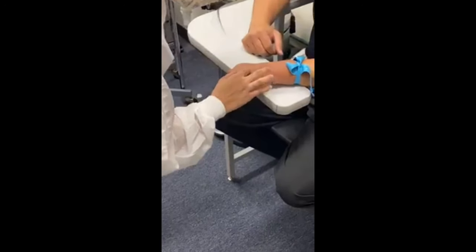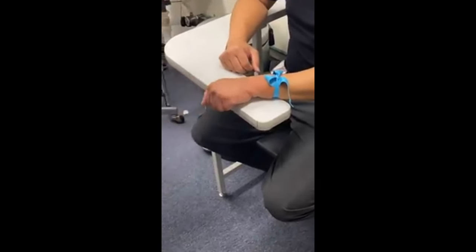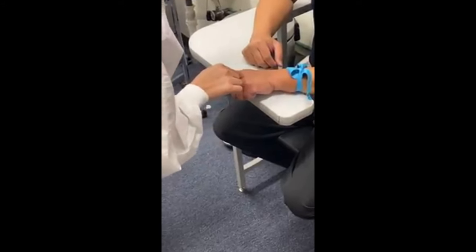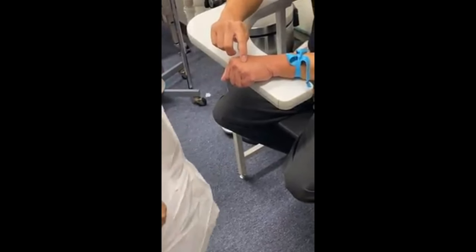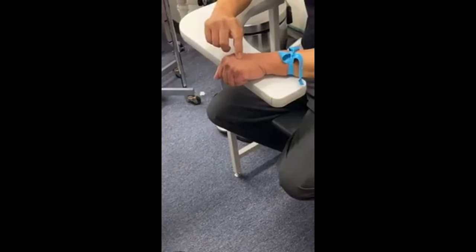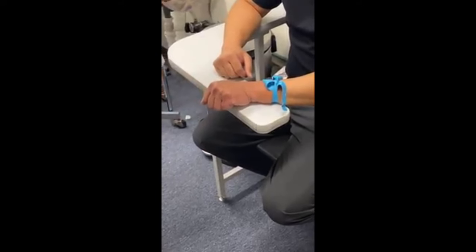But yeah, you'll encounter different kinds of patients. Okay, I'll do this one. That one there? Okay. If it's something like this, right? The V, we have to do up here? Like this? No, it's fine. As long as whenever you enter, it still maintains, if it's still going straight, you could enter here and then the bevel will end up somewhere here. As long as you're in the same path, it's fine. Okay then. Yeah, so however you want.